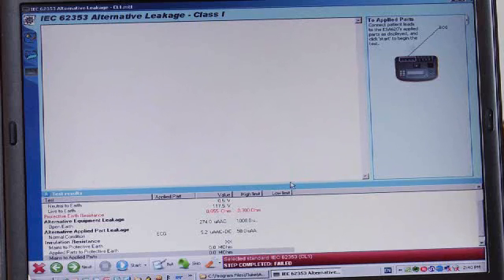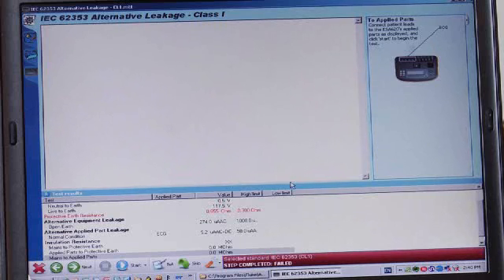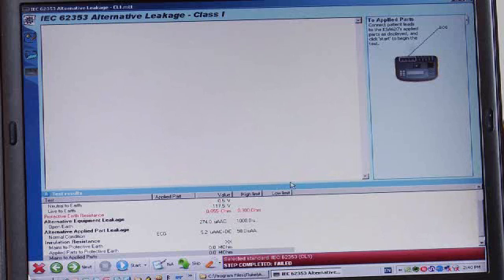In this case, the medical device that we're testing has failed because the ground resistance was too high.